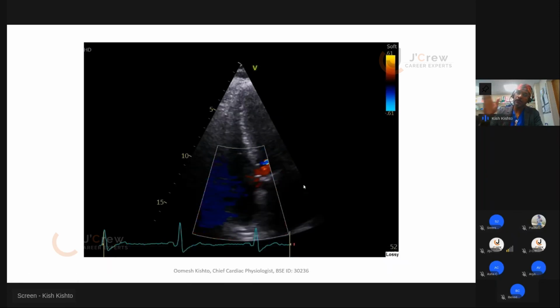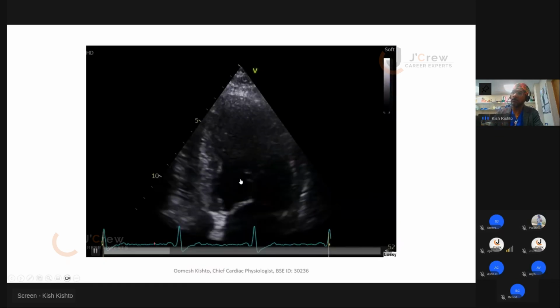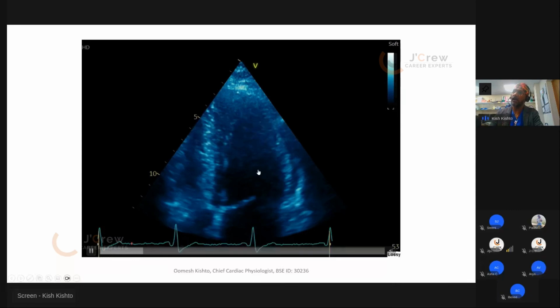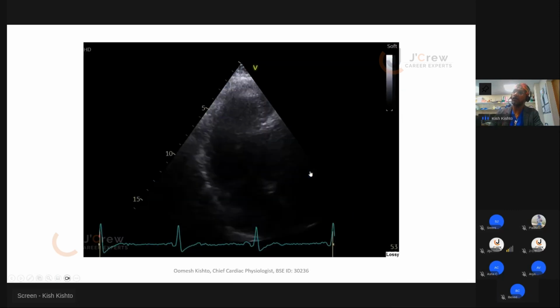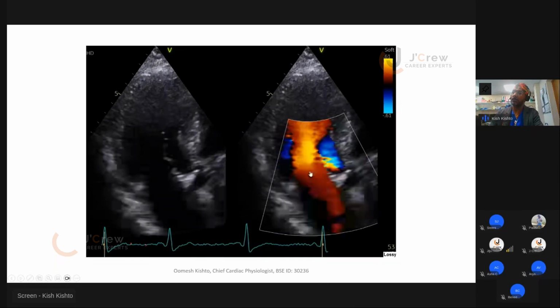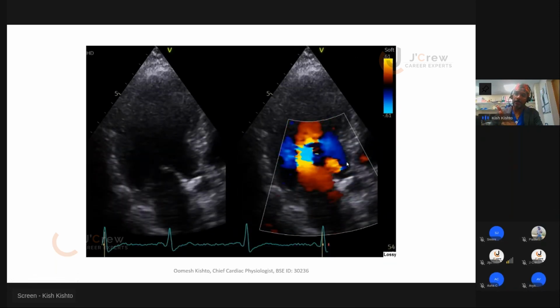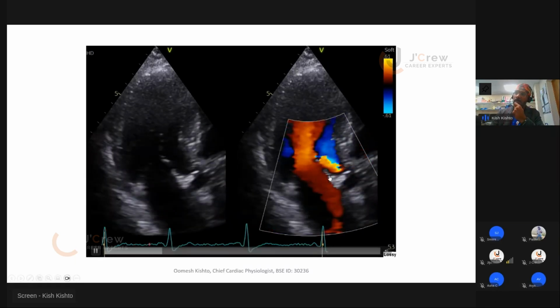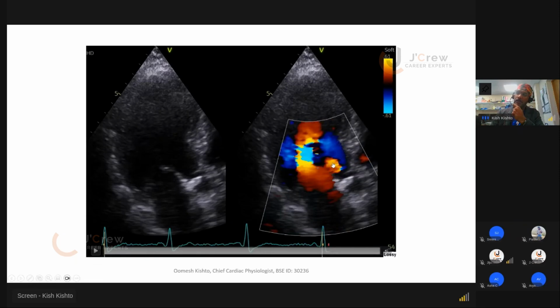So we've done this systematically, and then the same routine now. I will look at the right heart as normal, and then your LV, although our main focus here was the aortic stenosis. But again, in the three chamber view, guys, here now you can appreciate how broad that jet is.